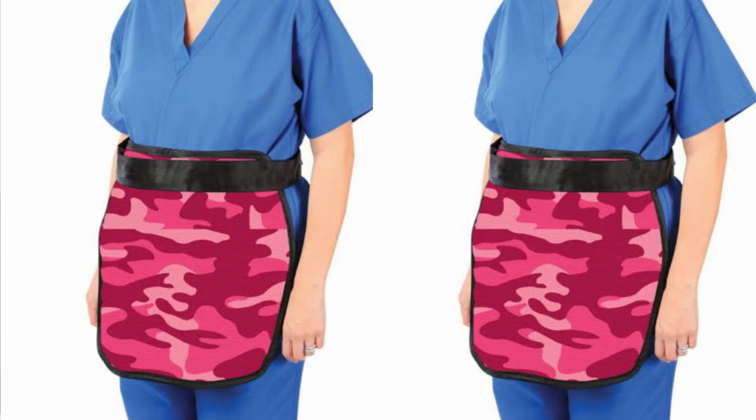And yeah, so if you're coming for a chest x-ray, I would give you a lead apron. It'll cover your reproductive organs, your ovaries, uterus. If you're male, it'll cover your genitals.